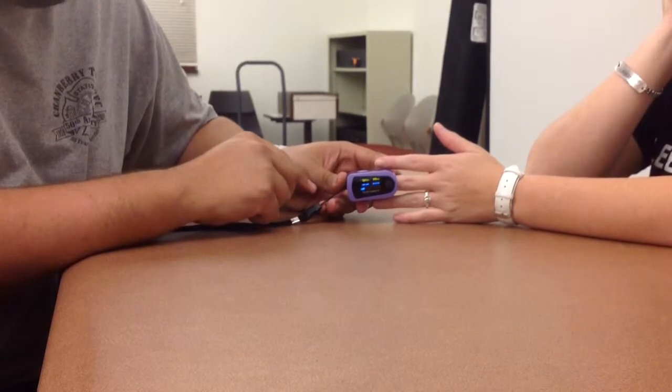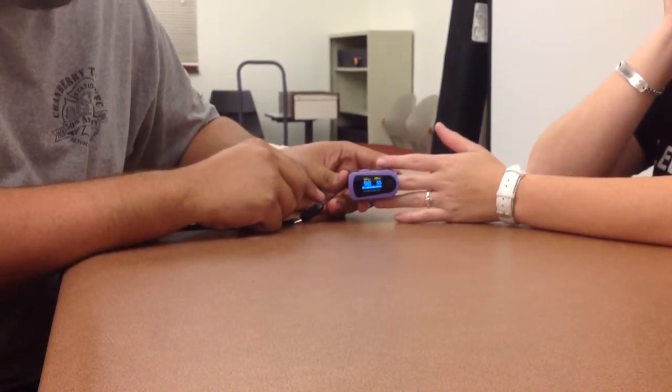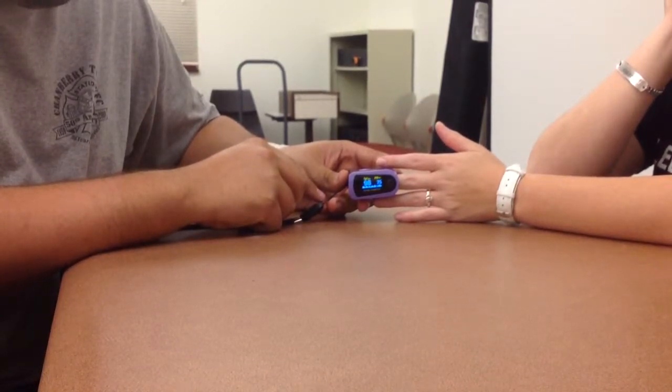The initial reading may not be accurate, so you'll want to let it sit for 30 to 60 seconds. A good suggestion is to take the patient's pulse or other vital signs while the pulse oximeter is reading.